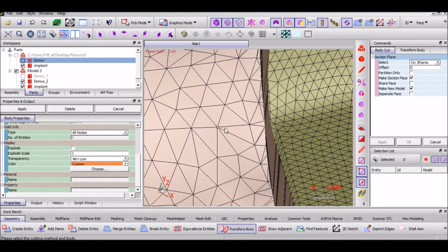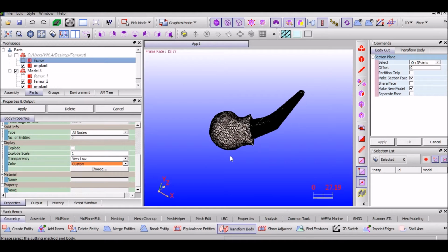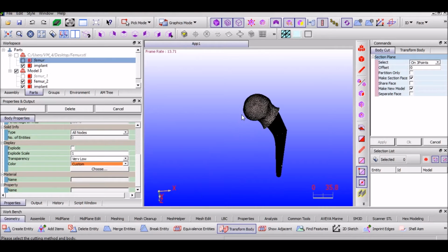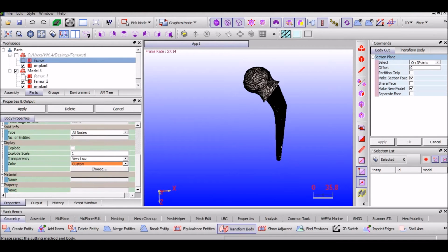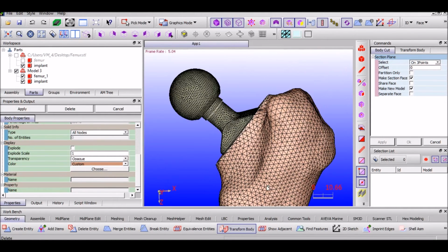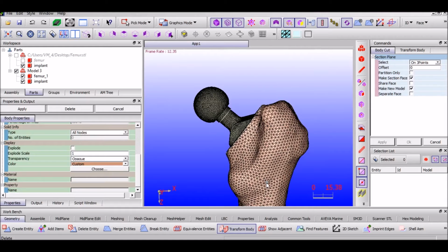And hence the femoral head has been separated from the rest of the femur. Now we need to delete the femoral head. And hence you have your implant assembly ready.